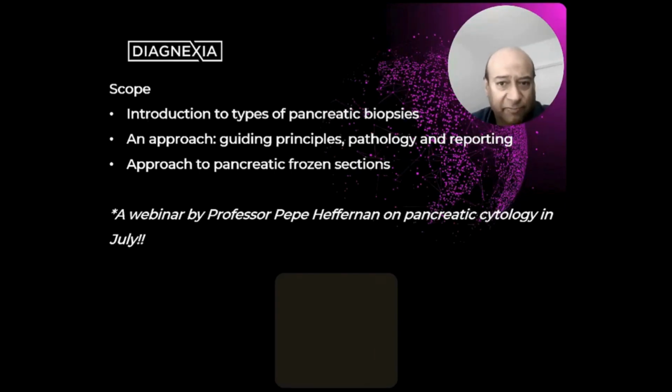Delve a little bit into the various pathologies that you will encounter, and then provide some clues and tips as to how best to approach reporting these. And then the final segment is an approach to pancreatic frozen sections.